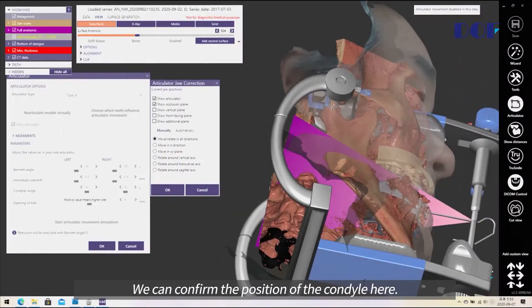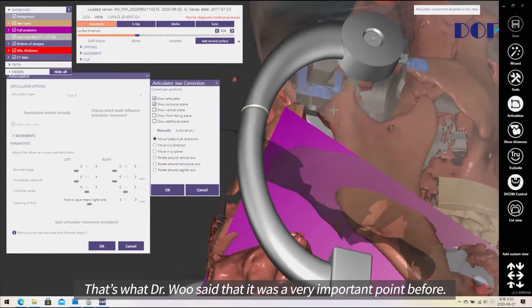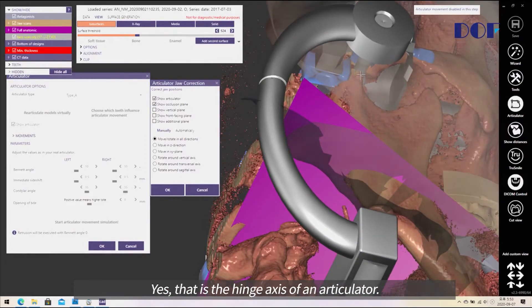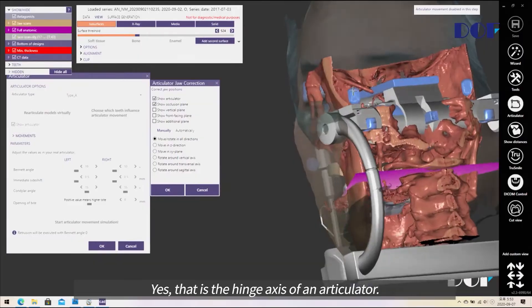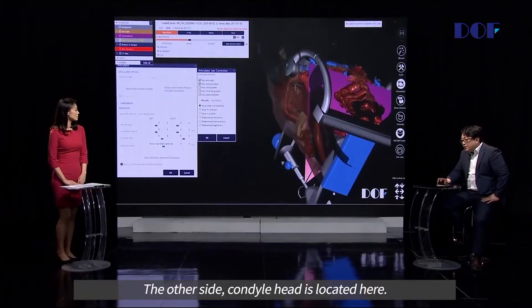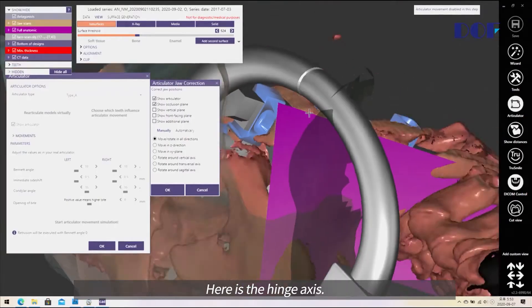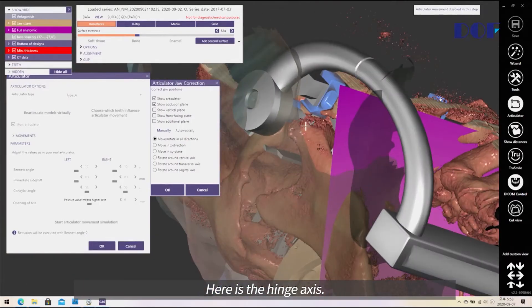We can confirm the position of the condyle here — that is why Dr. Wu said it was a very important point before. This is the hinge axis of the articulator, and on the other side, the condyle head is located. Here is the hinge axis.